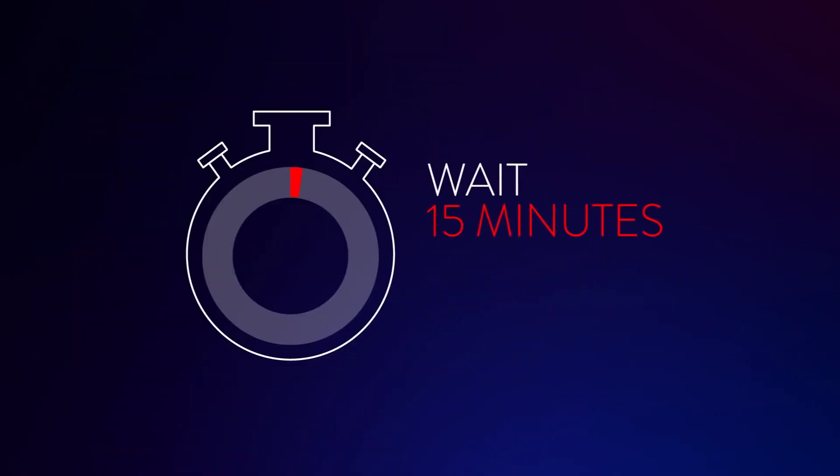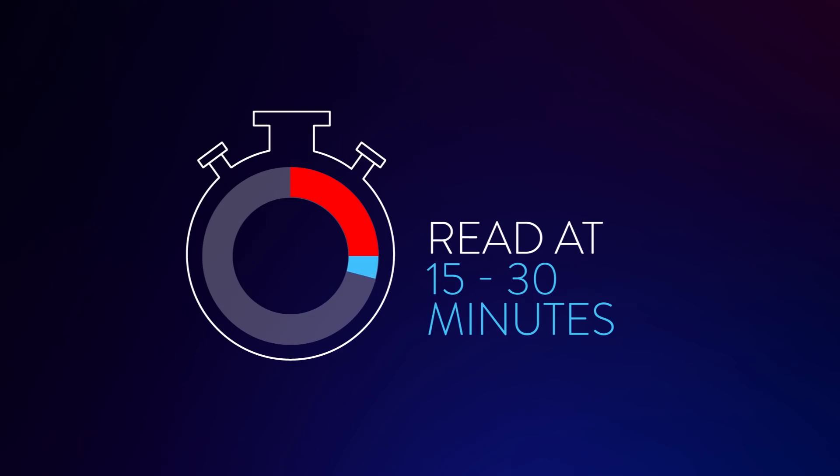Wait 15 minutes. Do not move or touch the card during this time. After 15 minutes, check your result. It is important to not read the result before 15 minutes. Results should not be read after 30 minutes.